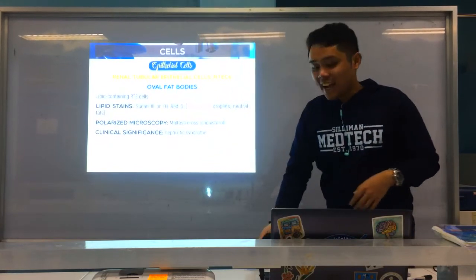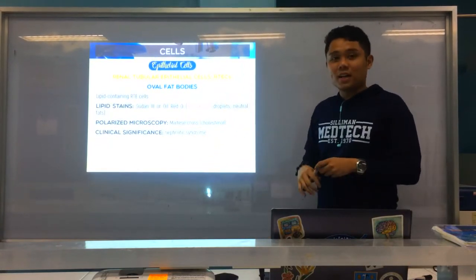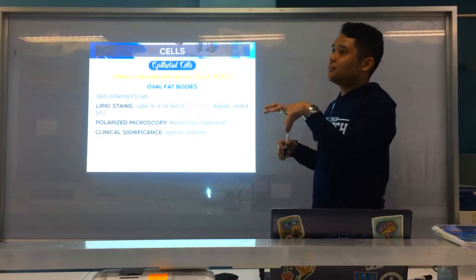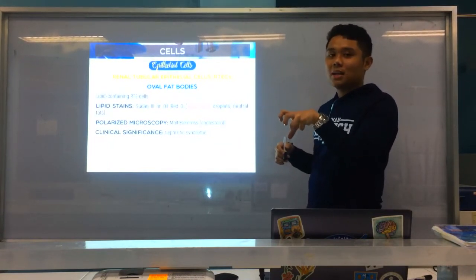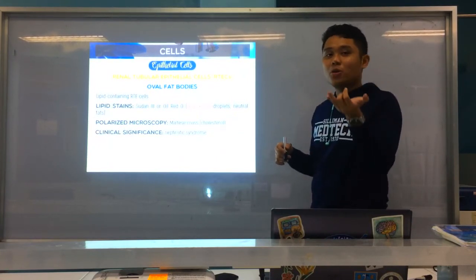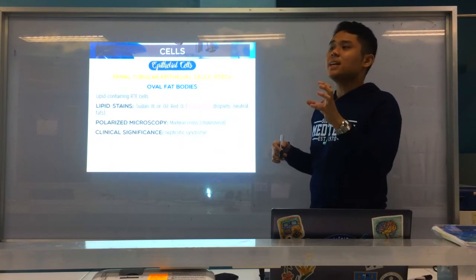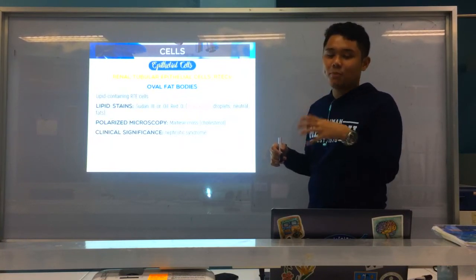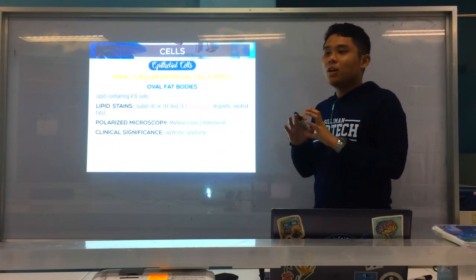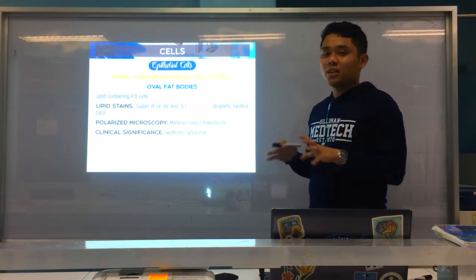Again, where do we see oval fat bodies? Nephrotic syndrome. Now, what is nephrotic syndrome? Remember in your renal anatomy, in your nephrons, we have the shield of negativity and podocytes. Because of these, the electrical charges are balanced, so there is an overall negative electrical charge.